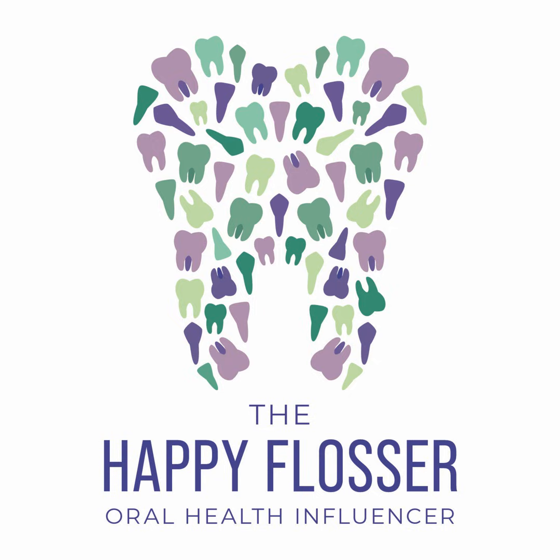You want to check each image as you take them so that you can make the necessary corrections. This is a really great habit to get into in order to avoid taking retakes. Sometimes if you take your premolar image and you are too far back, that may account for your molar image, and then you can retake your premolar image and be okay by moving forward. Sometimes when you take your molar image first, you may be too far forward, and that will be your premolar image, and that's okay too, as long as you make the necessary adjustments so that your next image captures the areas and anatomy that you missed on the first one.